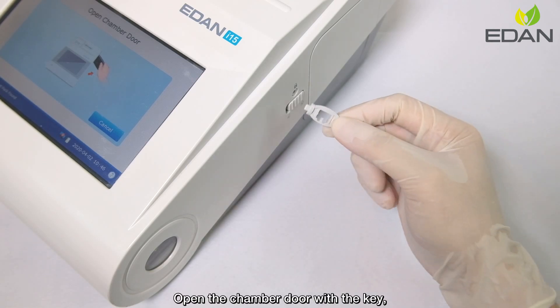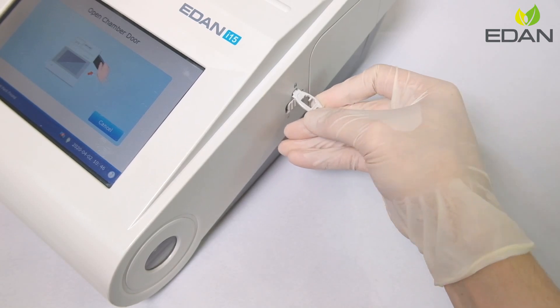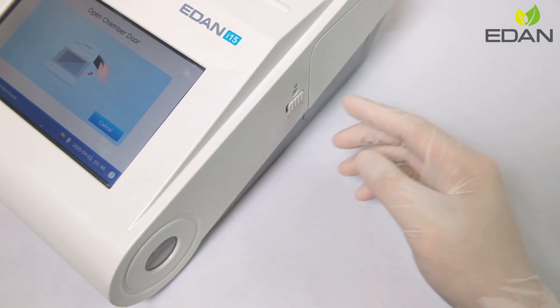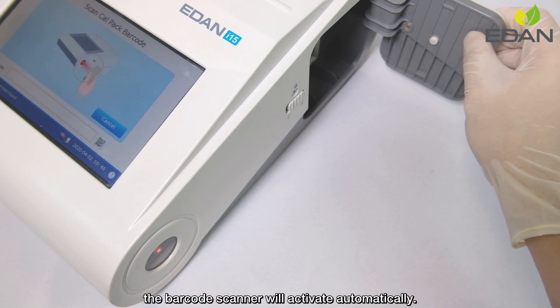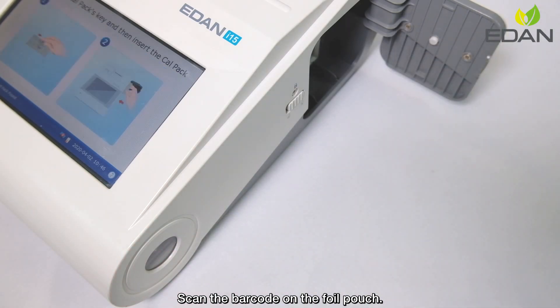Open the chamber door with the key. The barcode scanner will activate automatically. Scan the barcode on the foil pouch.